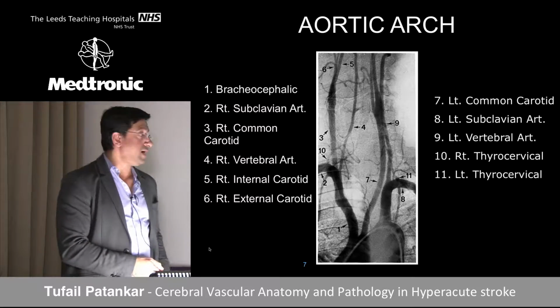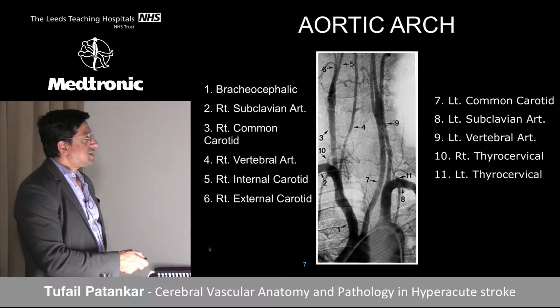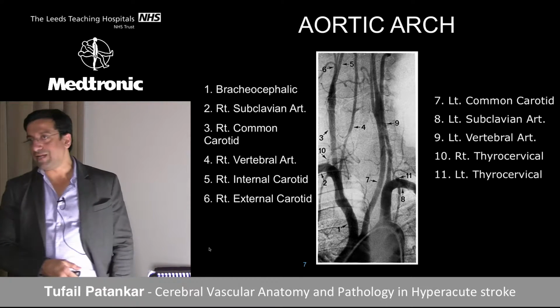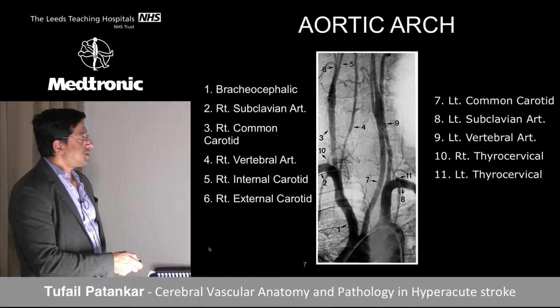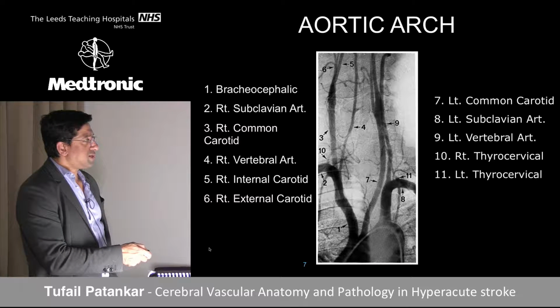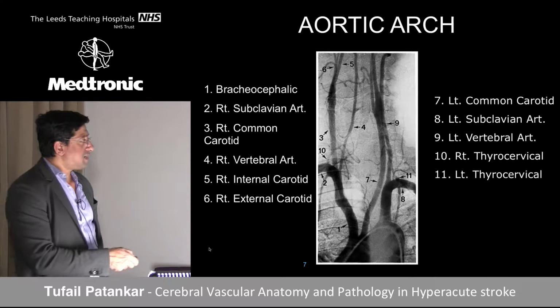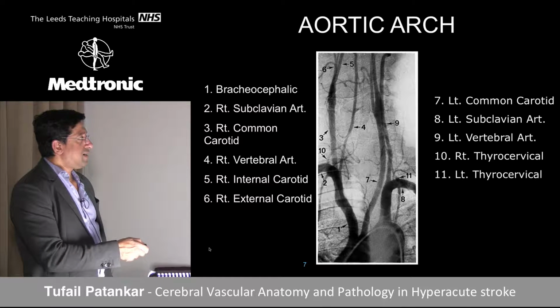Or is it okay? Okay, so you've got an arch here, as you can see, and you can see one vessel which goes to the left. It's going to be the left carotid artery. The other one here is the left subclavian artery, and you can see the vertebral artery. Quite often you will see the vertebral artery here twist and turn around here as we get older. But that's the left carotid, left vertebral artery.